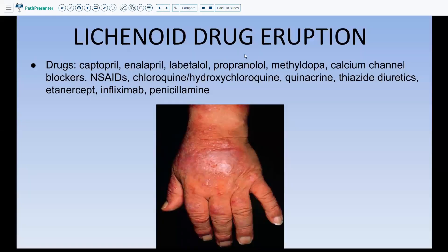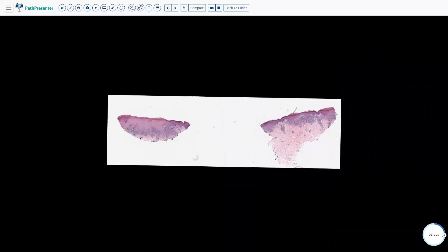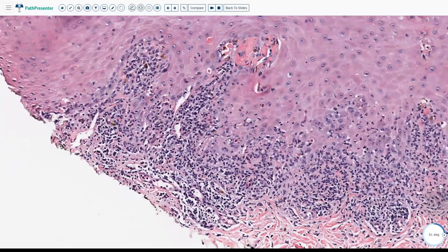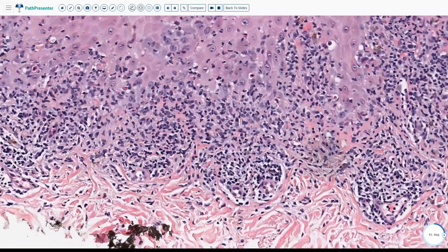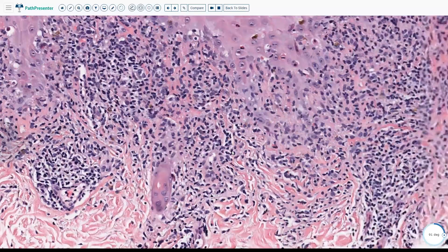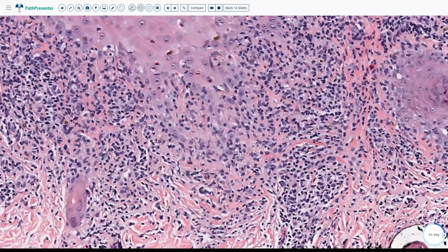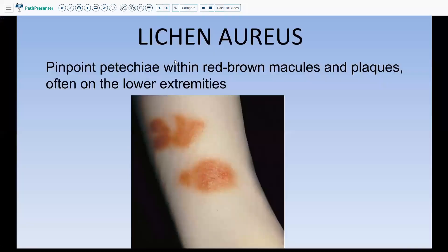Lichenoid drug eruption can be caused by multiple drugs. The reason you need to look at the lichenoid infiltrate at high power is that anytime you have a lichenoid infiltrate, you go to high power and scan the slide from one end to the other. You see the dense lichenoid infiltrate and dyskeratotic keratinocytes, but now you also see admixed eosinophils. If you find eosinophils within the infiltrate, then more likely the diagnosis is a lichenoid drug eruption. You scan the entire slide for scattered eosinophils, then you say: lichenoid dermatitis with admixed eosinophils, and note that the presence of eosinophils is suggestive of a lichenoid drug eruption.